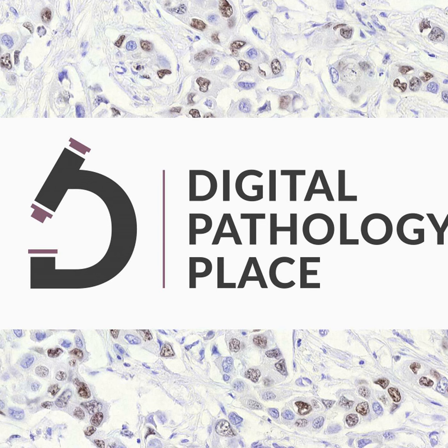Mm-hmm. And of course, that started to happen, I guess, something like 20 years ago, that we started to motorize microscopes and grab slides field by field, and then after 3 hours of scanning, you would have one image. Did you have something like that in your lab? We did, yes. Actually, we had very early prototypes, but it would never scale. It would be nice. You would have very cool images. And of course, the hardware was not capable of dealing with all the data. So you would have nice images, but you couldn't really use that.